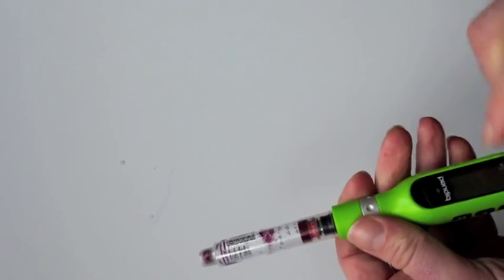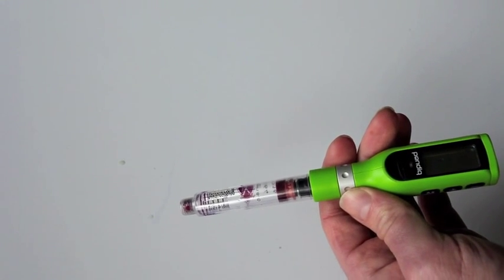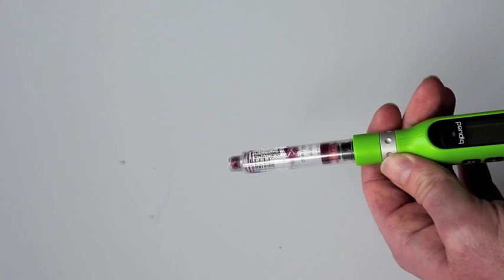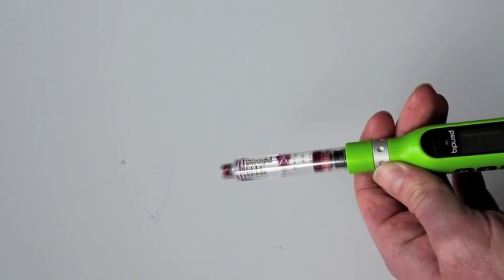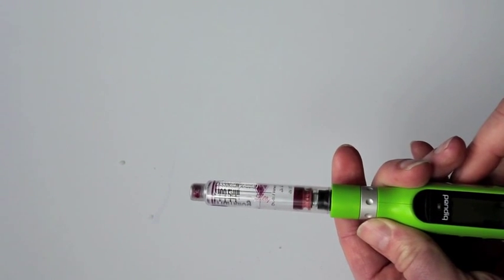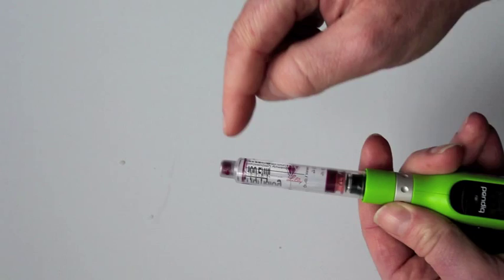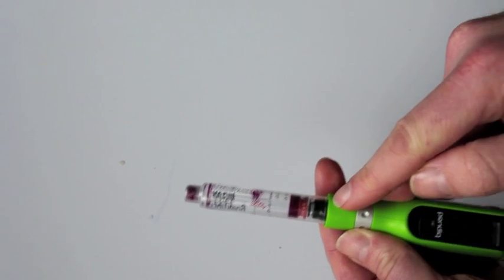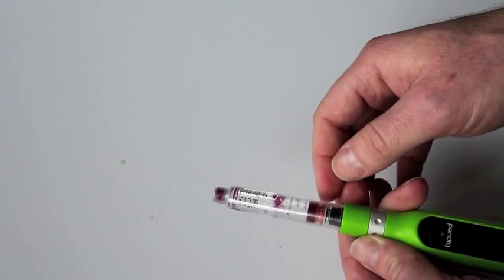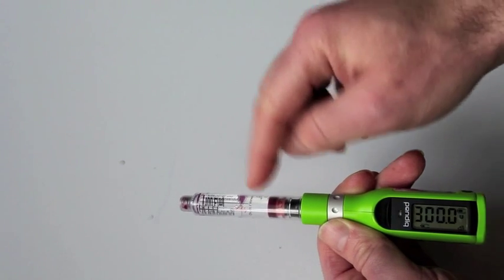Now, before we put the needle in there, we're going to have to run it forward. Press ACT to start the process of driving the plunger forward. When you do this, you really want to make sure that you don't put the needle in first, because this is putting the plunger all the way forward to take out the empty space. If you had a needle on here, it would just be throwing the insulin away. So you don't want to do that. You can see here it says we have 300 units — that means it's a full container.